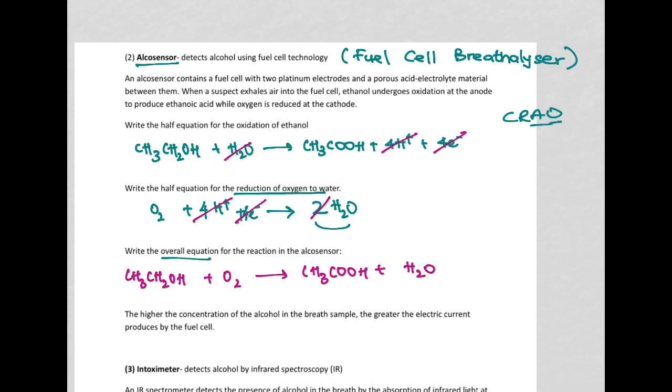And the higher the concentration of the alcohol in the breath sample, the greater the electric current that is going to be produced by the fuel cell.